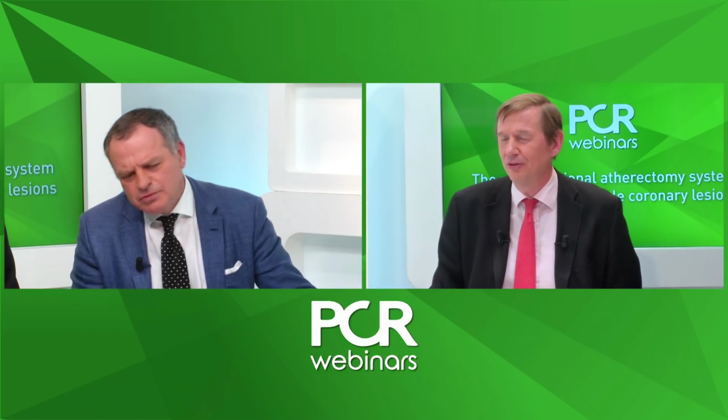But when we had the consensus meeting, there was very wide variation in practice, and most people felt very strongly about what their particular number was. But what is quite clear is that doing 175 at 220,000 RPM is not really standard practice now. If you are unable to penetrate a lesion using standard equipment, what would you do? If you are unable to get through a lesion with your 1.5 burr at 160,000 RPM, what would you do next?